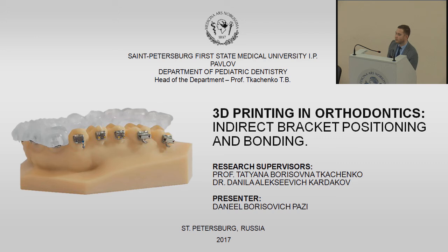No, the method is that you are bonding the brackets yourself manually. So it's not done in a program, right? Only the models are created, computerized. So you can choose whatever bracket system you want. And if it is also combined with some surgical treatment like implants and so on, you can also plan that. And with the 3D printing of bone, you can actually do some cooperative work with the surgeons in your office. It would be way more useful for them to actually hold the bone they will operate on, rather than looking at it on the computer.